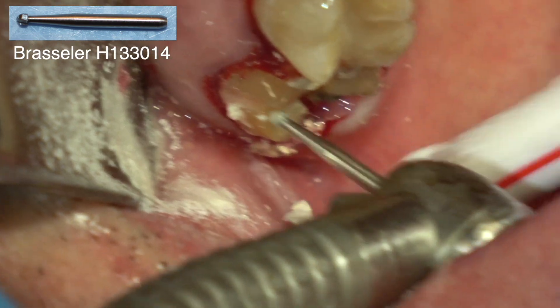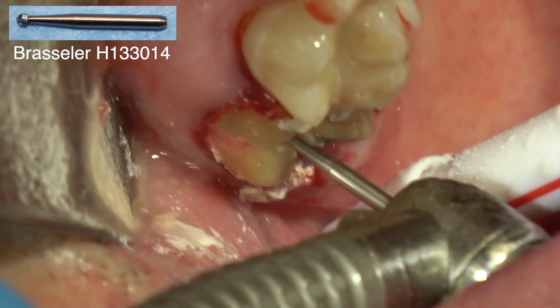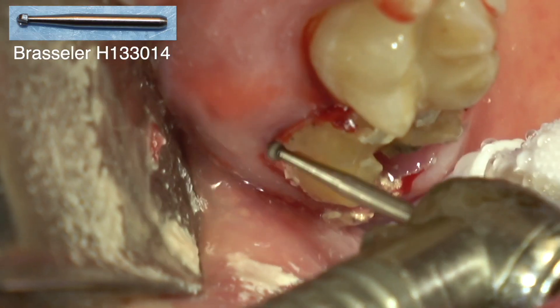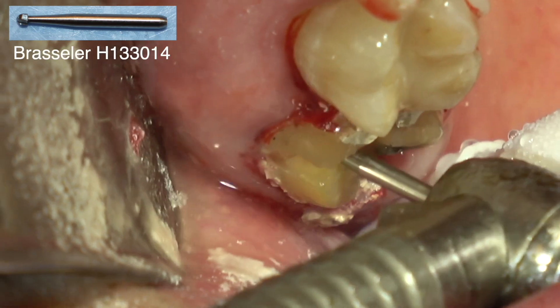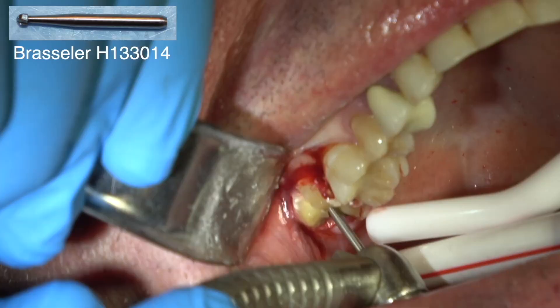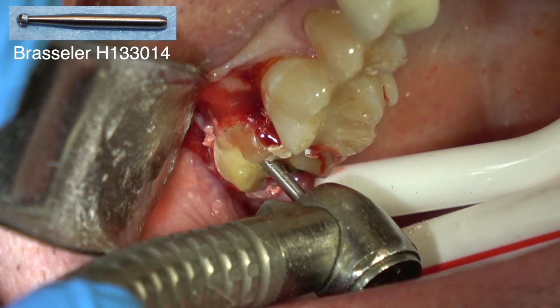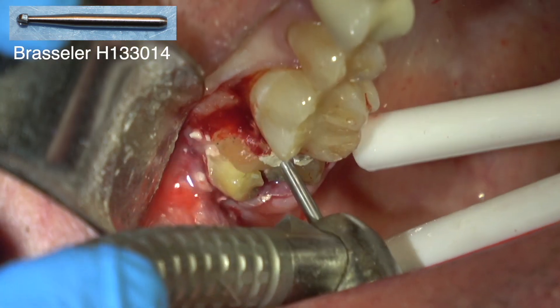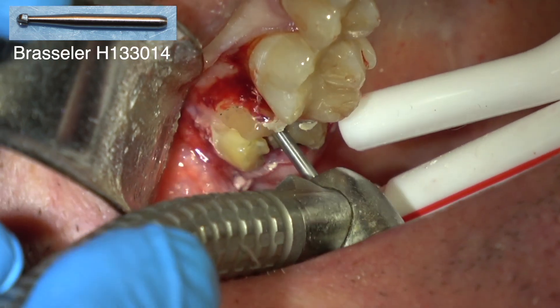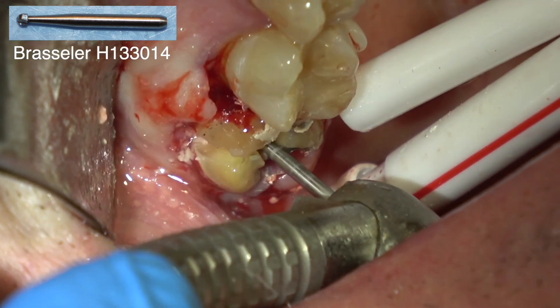Now I'm going to separate the mesial buccal from the distal buccal roots. This is tooth number two — the upper right second molar. This is the mesial buccal root, this is the distal buccal root, and this is the palatal root over here. These mesial buccal and distal buccal roots are often really brittle, so I want to cut all the way through the furcation on the buccal and mesial-distal — but I don't want to cut through the buccal plate. Just through to the furcation.